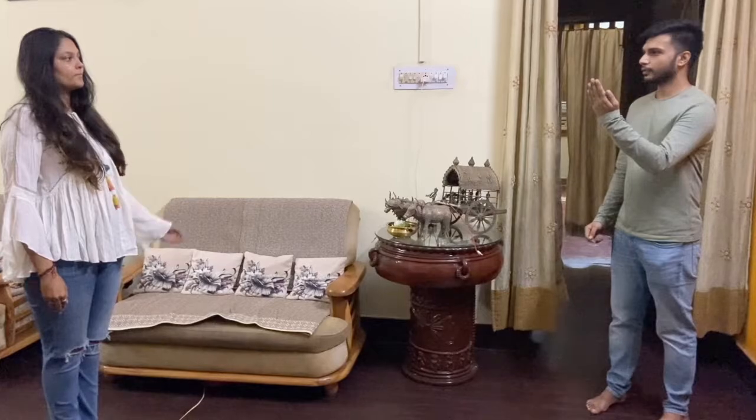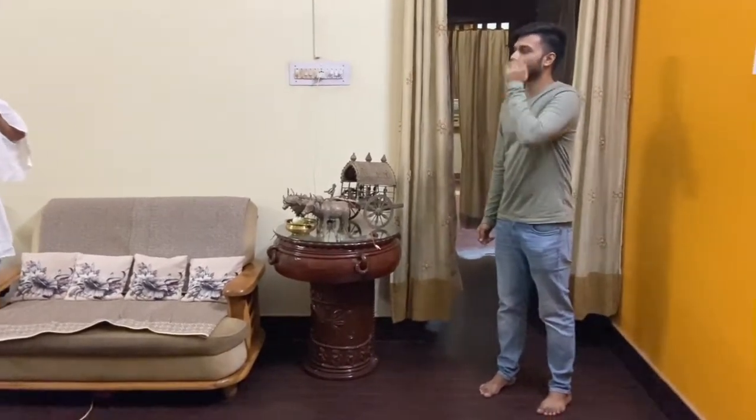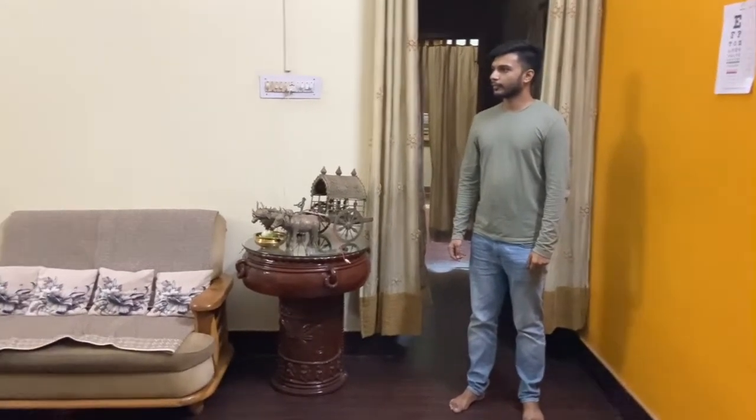So, 20 by 30 is her right eye. That means 20 is the distance of the patient from the chart, while 30 is the distance at which a normal eye can read the line of letters.